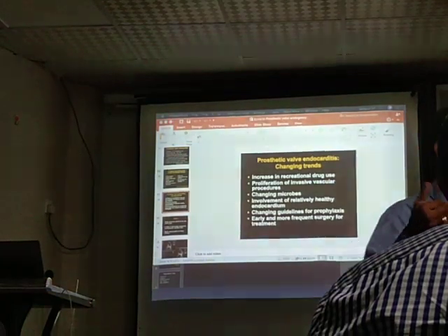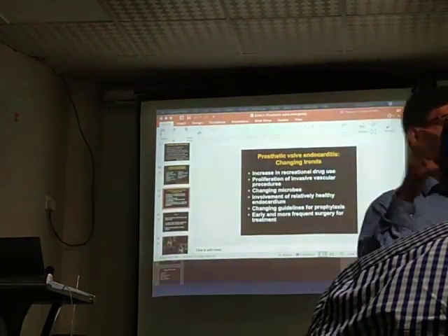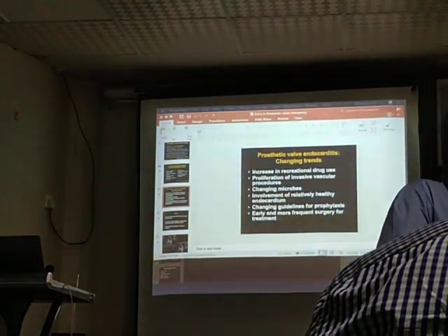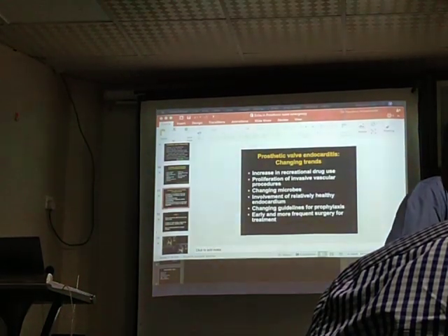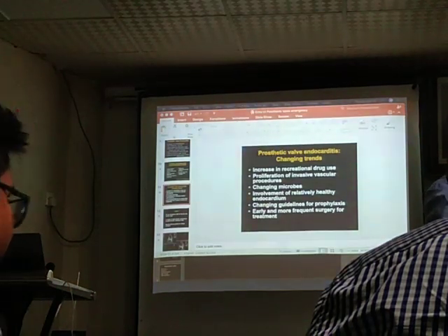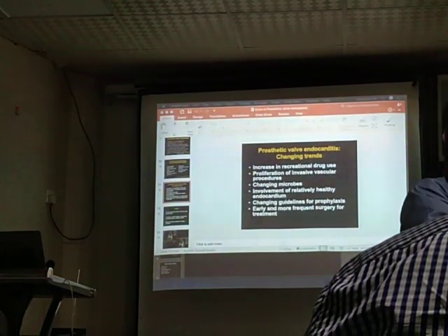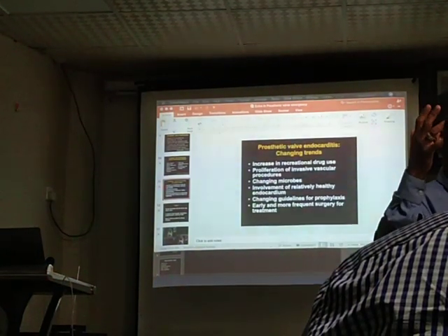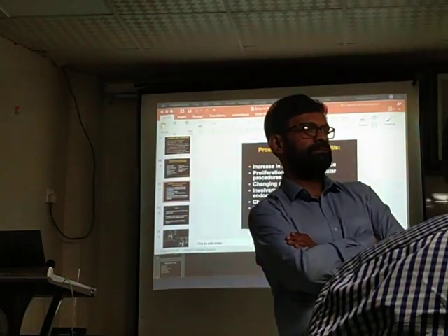On the mitral valve, 2.5. Aortic valve 2.5, especially I think this is a high flow state. But how much is stenosis? It has to be mild. Mitral valve area by planimetry, and gradient. Because it is hemodynamic, gradient is dependent upon heart rate and LV pump, so it changes.